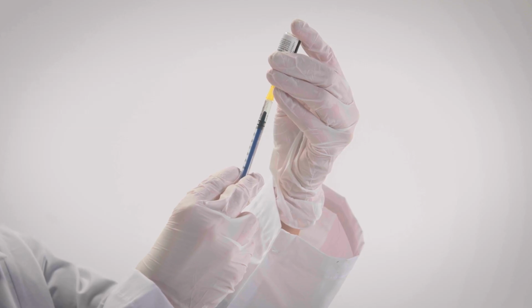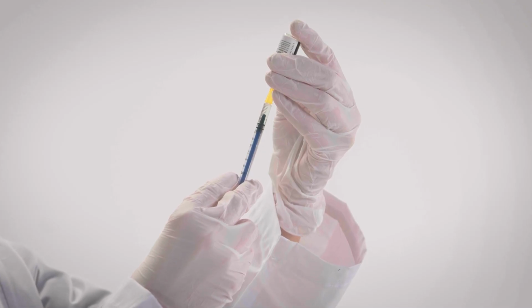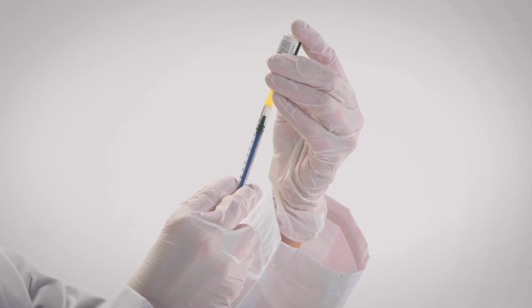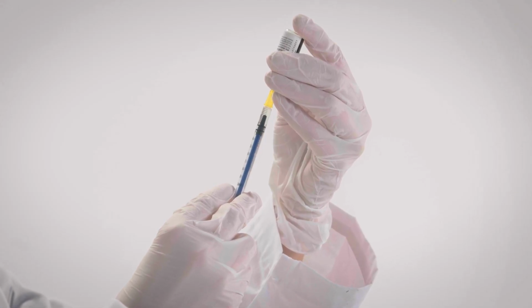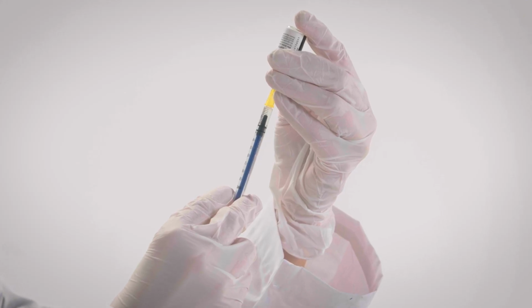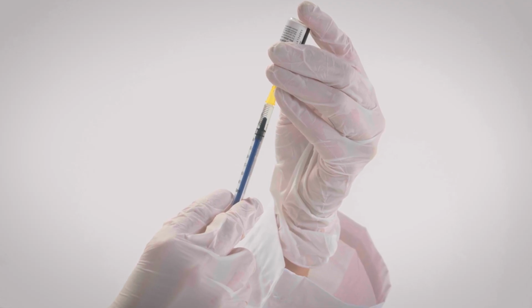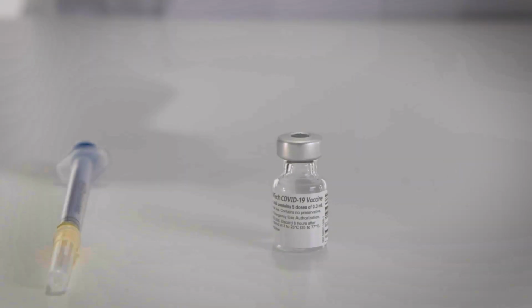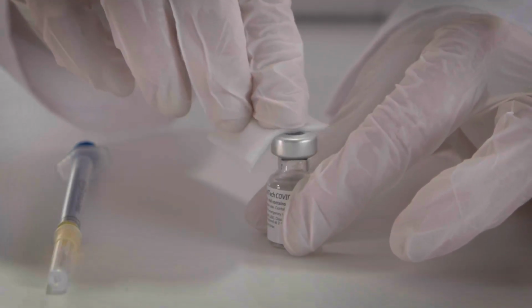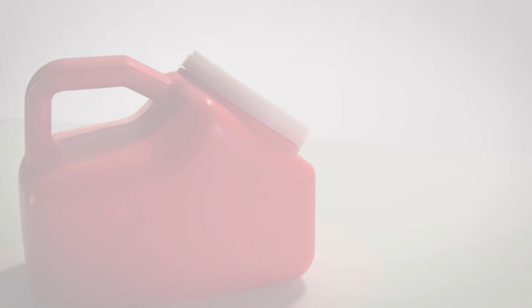Adjustments to remove air bubbles should be done with the needle still in the vial to avoid loss of vaccine. It is recommended to use the same needle to withdraw and administer a single dose whenever possible. If a second needle is required for administration, pull back on the syringe plunger until a small amount of air enters the syringe prior to removing the first needle to avoid loss of the vaccine during the needle change. For each additional dose, use a new sterile syringe and needle and ensure the vial stopper is cleansed with antiseptic before each withdrawal. Be sure to immediately dispose of used needles in a sharps container.